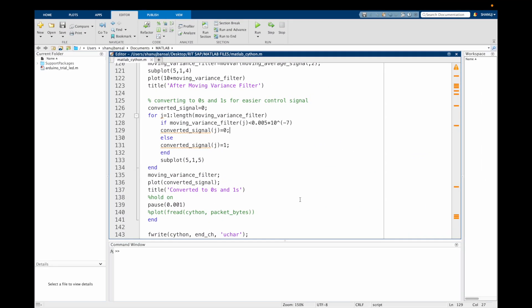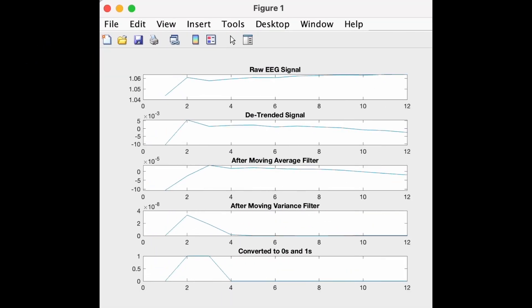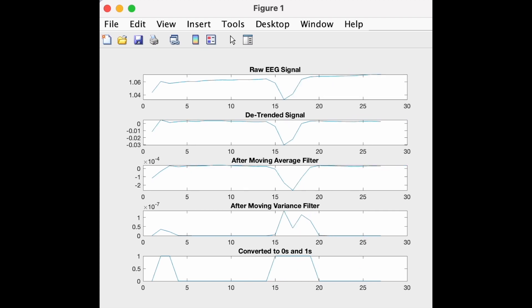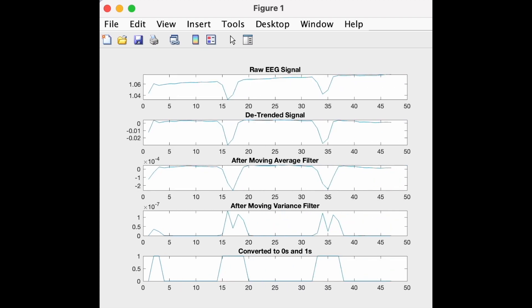Now I have converted this to 0s and 1s so that it is easy to give a command to the mechanical system that we will connect in the next part of the series. After seeing the data values of the moving variance filter output, I have set an arbitrary threshold value. Now if any value of the data is below this, it will go to 0, and above it will go to 1. As you can see, I am clearly able to detect the eye blinks in MATLAB in the form of 0s and 1s.